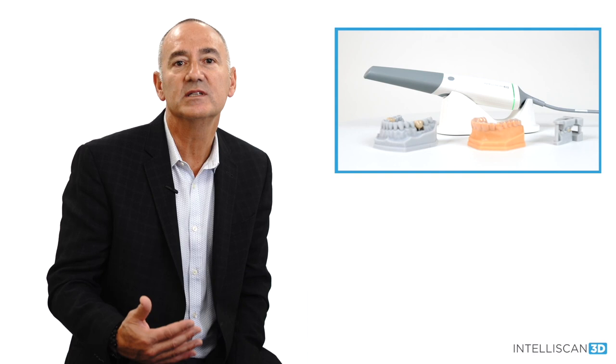I'm going to also introduce to you an evolutionary new scanner, the IntelliScan Model X — a scanner built for all practices and has the ability to adapt to any practice's specific needs.